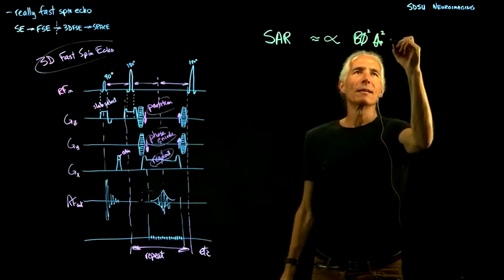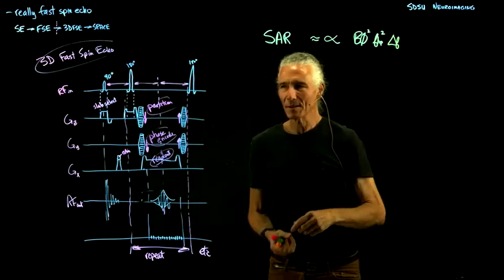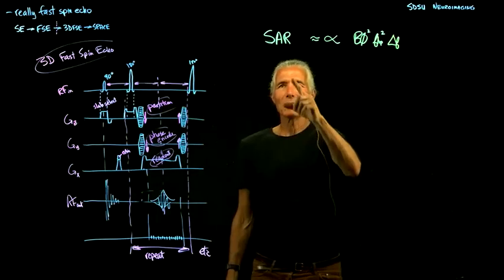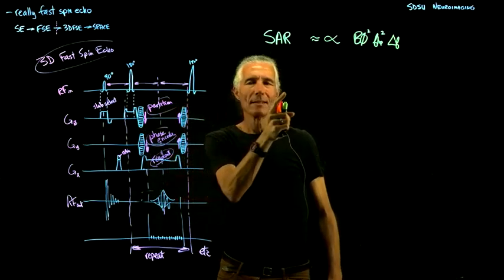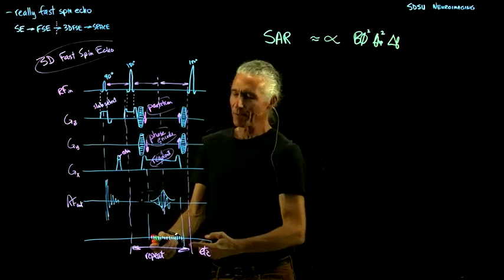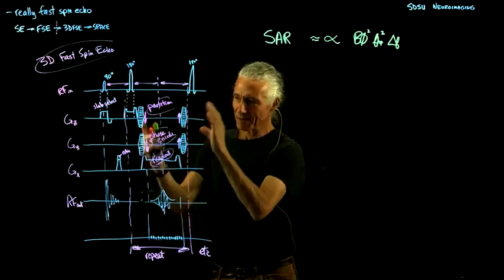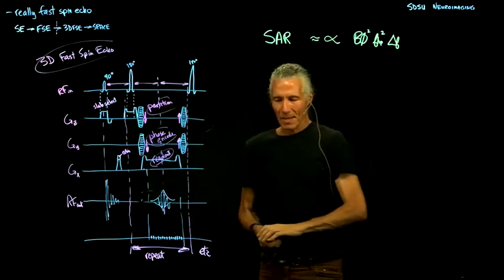And it's also dependent on what is the range of frequencies that you're using. So if you're using a hard pulse with a lot of different frequencies in it, that's going to also increase your RF power. So this is a problem, especially for a pulse sequence like this that's going to have like a zillion 180s, because remember how many lines of this we have to, this is just one line of data, might have 256 points, but we need to collect 10 million of these, 10 million data points. So we're going to need like 64,000 repeats of this. So 64,000 180s, that's a lot of 180s. And so there's a problem with this.